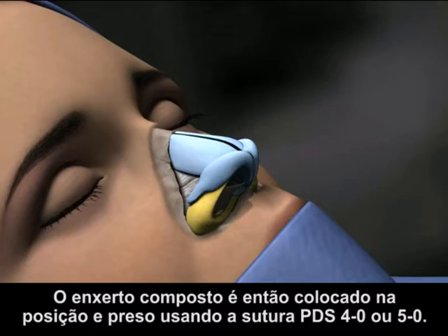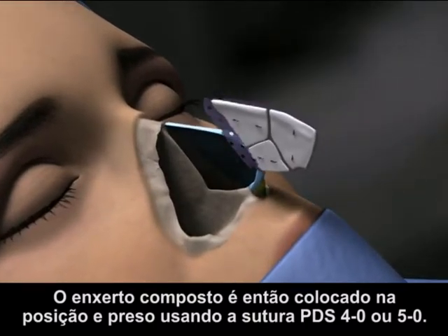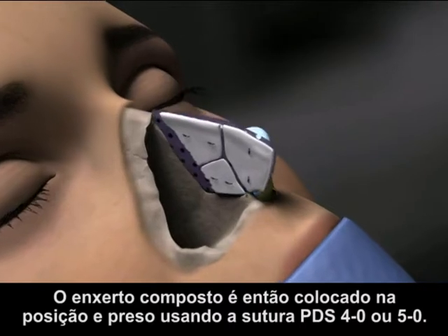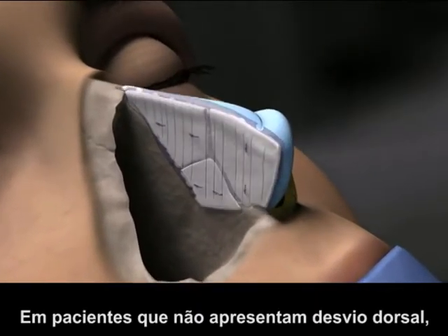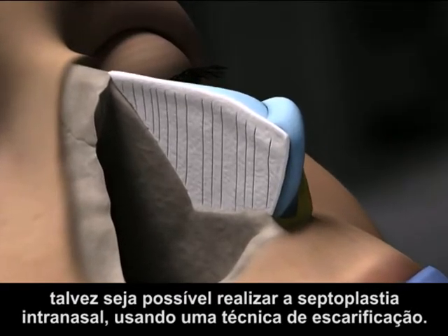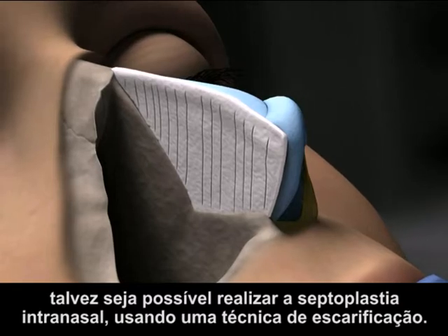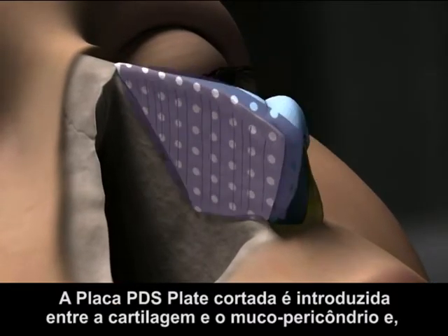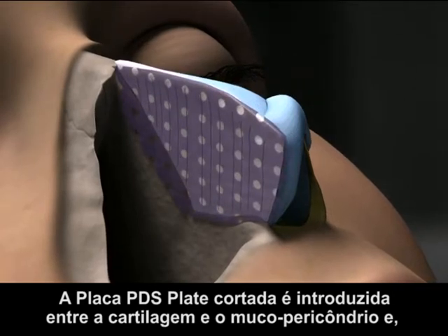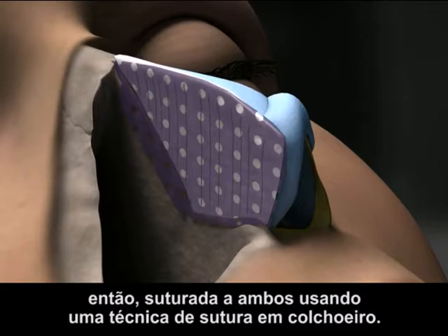The composite graft is then placed in position and secured using 4-O or 5-O PDS Suture. In patients who do not exhibit any dorsal deviation, it may be possible to perform septoplasty intranasally using a scoring or etching technique. The trimmed PDS Flexible Plate is inserted between the cartilage and mucoperichondrium and then sutured to both using a mattress or quilting technique.